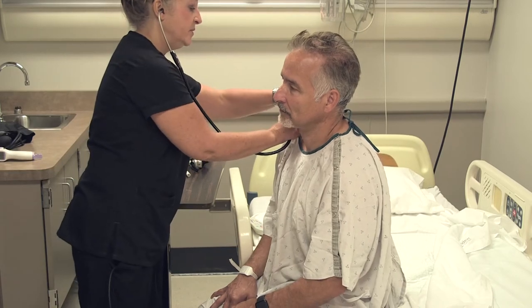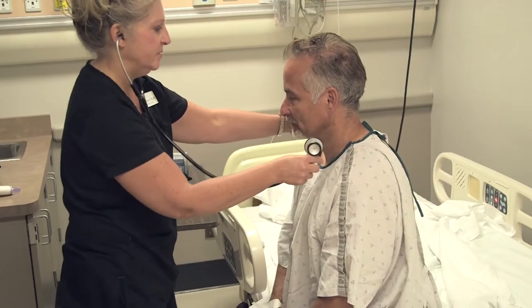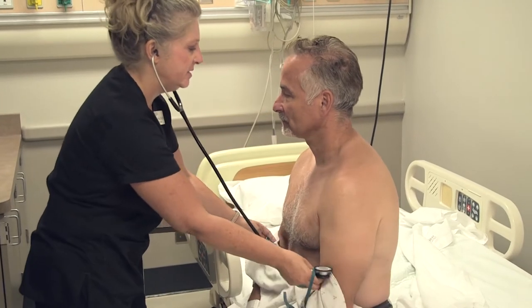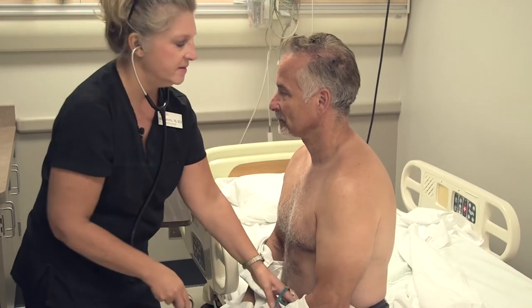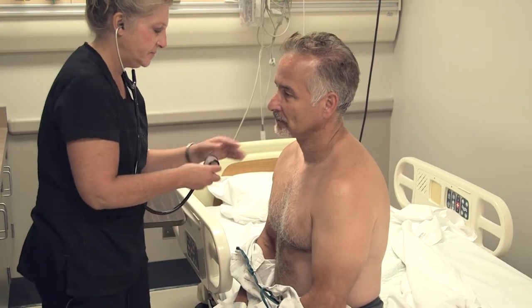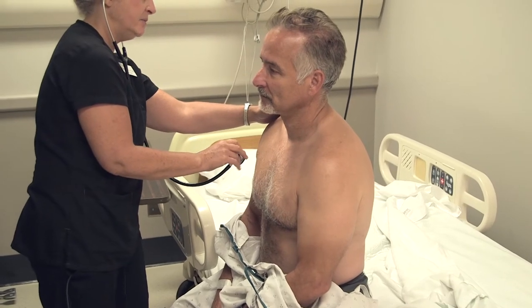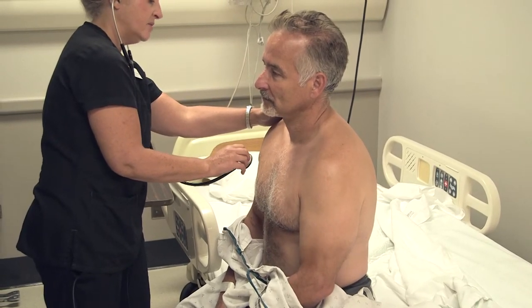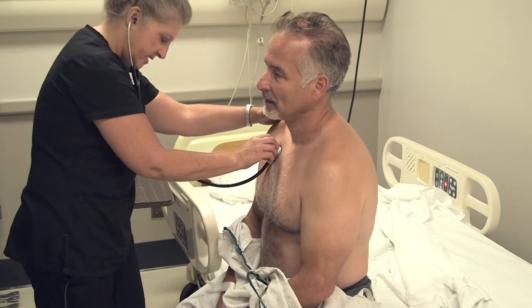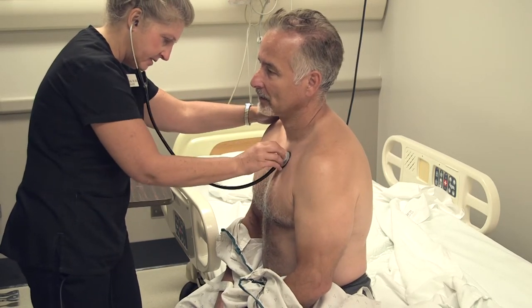So what I'm going to do, Tim, if you don't mind, can I just slip off your gown? Would you be okay with that if I just slip it down a little bit so we can all see? Okay, there we go. All right, so I'm going to go ahead and start listening. As I place the stethoscope, that's when I want you to take a deep breath. If at any time you feel dizzy or lightheaded, let me know. Okay, Tim, take a deep breath, in and out. Blow it out. Good. Just like that, in and out.